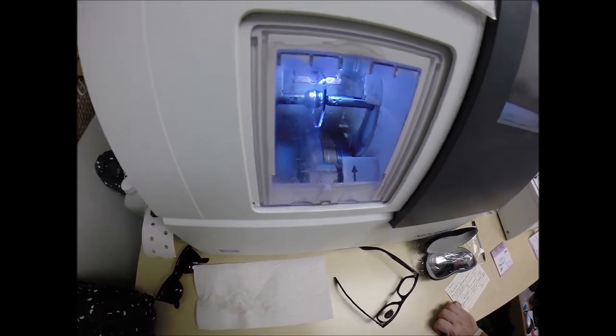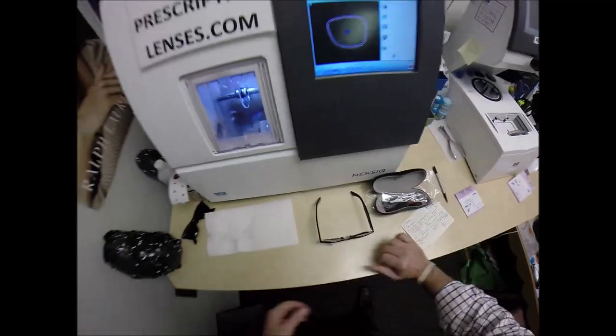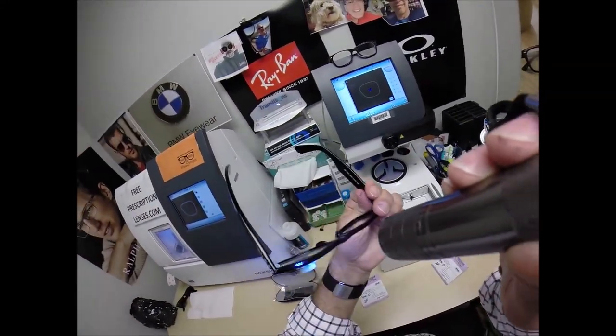It is seven o'clock here so it's probably like one or two in the morning in Italy. Let's go around tracing the shape of the left side of the frame, measuring where to place the bevel so you have the least amount of edge thickness showing — and look at this, Davani: you've got nothing. No edge thickness whatsoever.